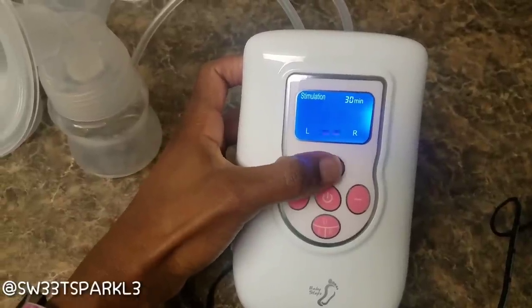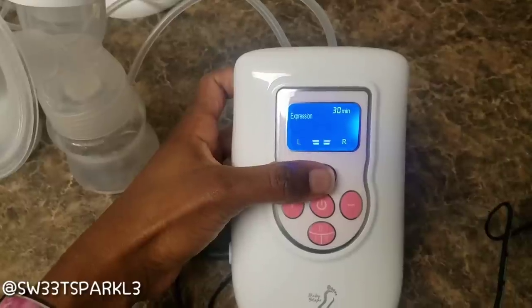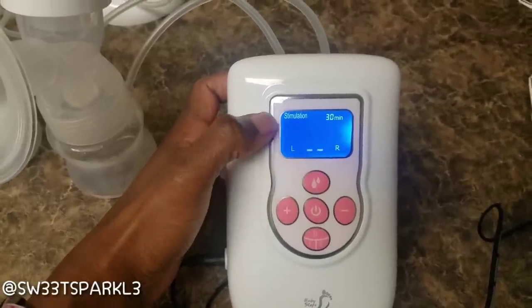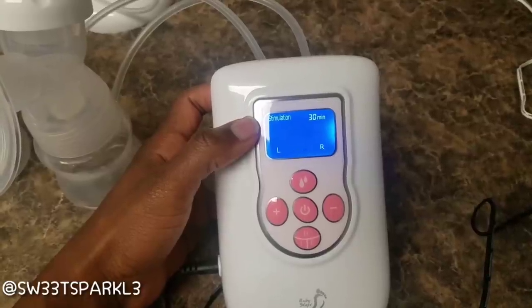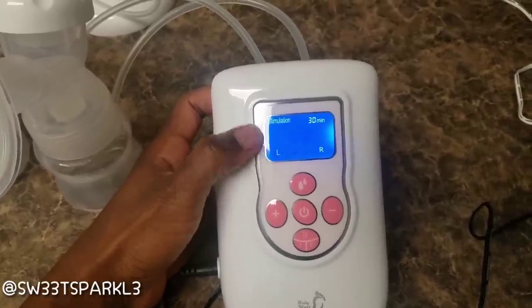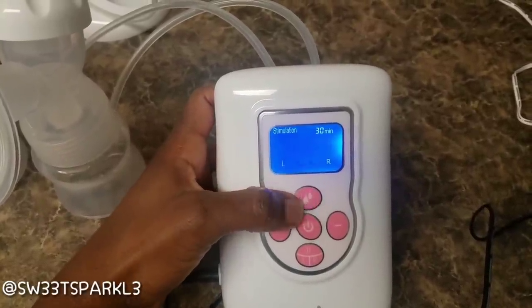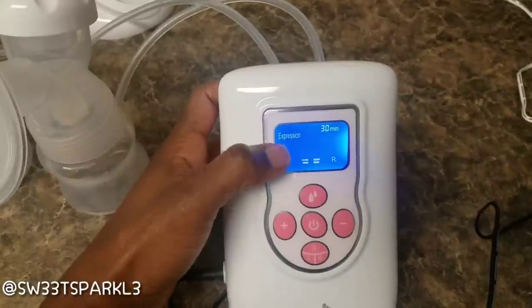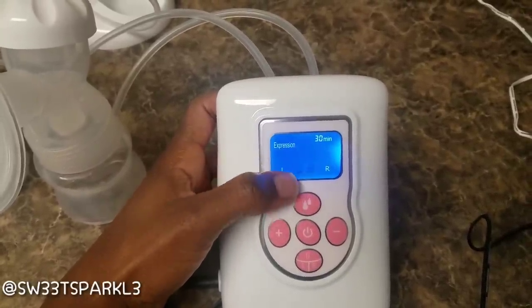When it first comes on, it enters stimulation mode. You can change that to expression mode with the milk button right here — press that and it'll go to expression mode. If you don't know the difference: stimulation mode is supposed to help some women with their let-down, to get their milk flowing. But I personally have never needed that, so I always go to expression mode, which is the mode you want once your milk is already flowing.